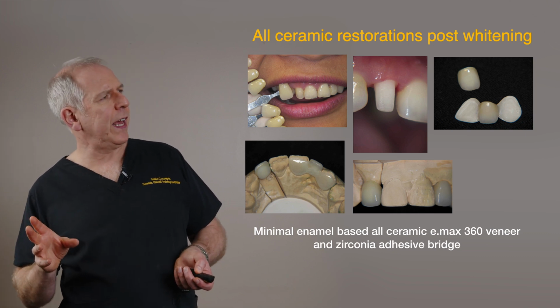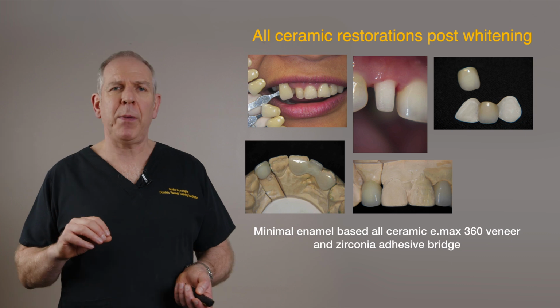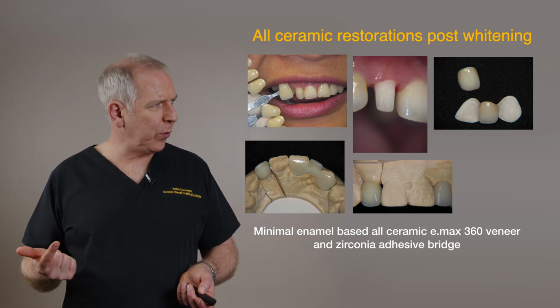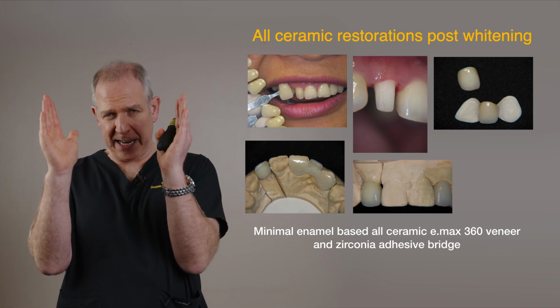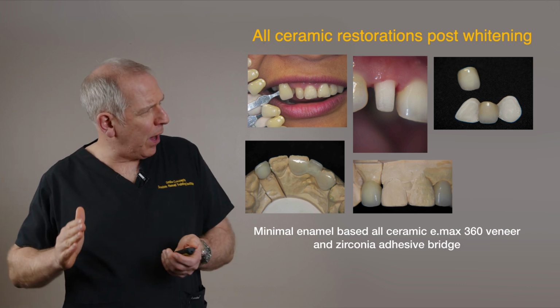And some of you will look at that and go, double abutted. Yes, it's double abutted because it's post-ortho. So the beauty of double abutting post-ortho is that then is our retainer. It's like a retaining wire on those adjacent teeth. Because if we don't double abut, we've got an issue.